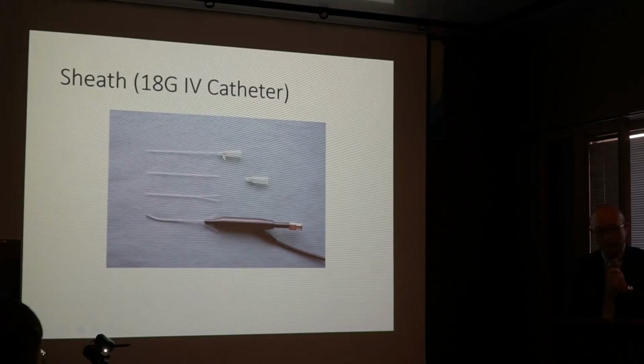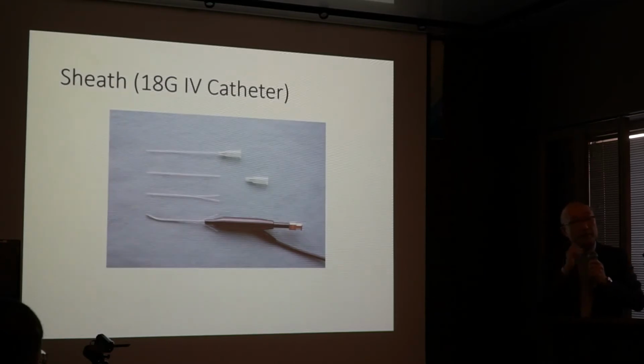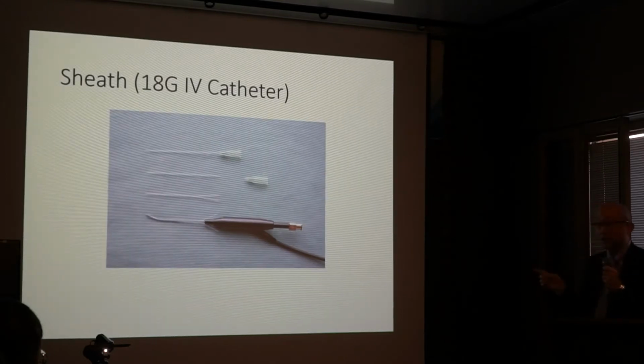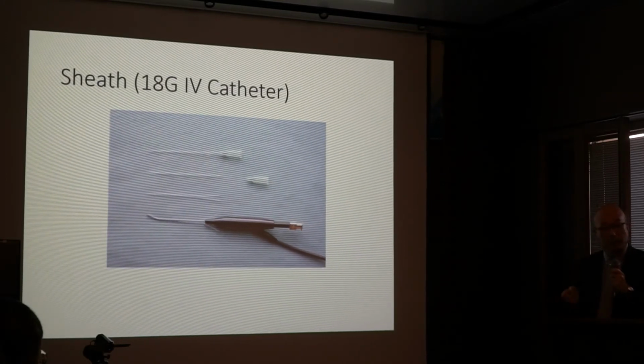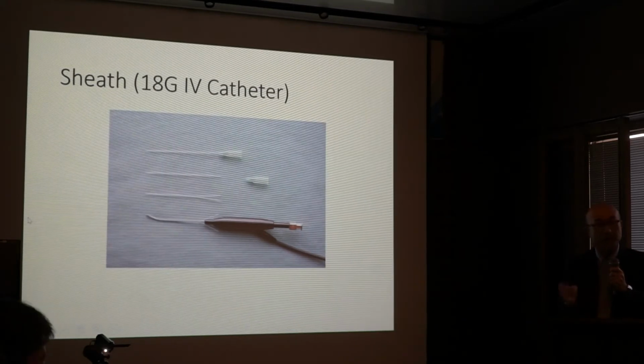Cut the end of the catheter and make a split here and fit it onto the endoscope probe, and we can use this as a lacrimal trephine when performing recanalization. Or we can use this as an intubation guide when performing intubation. This is very useful and very cheap.